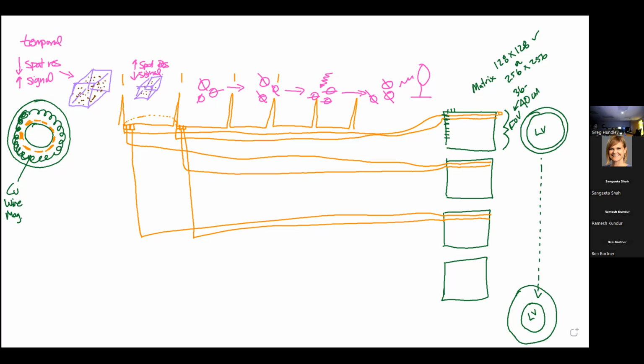Why do we not say always hold your breath in? Diaphragm might be in the way. No, because some people might go, and then on the next one, after you sit in there for 45 minutes, you're like, yeah, right. You just hold your breath in for different amounts of the inspiratory cycle, different tidal volume. So more commonly, we do breath out because everybody breathes out about the same amount. But if you have someone that's going to be a little bit anxious, you can do, hold your breath in. But just explain that to them, right? That helps with the picture taking process.